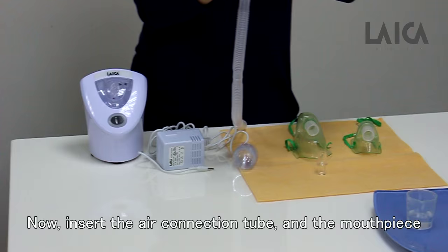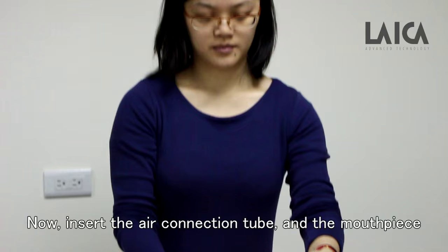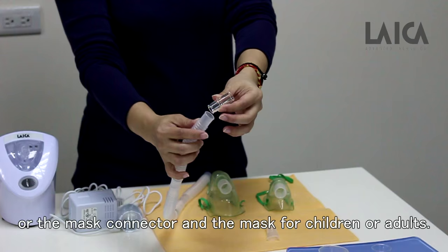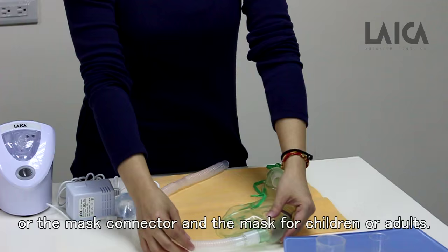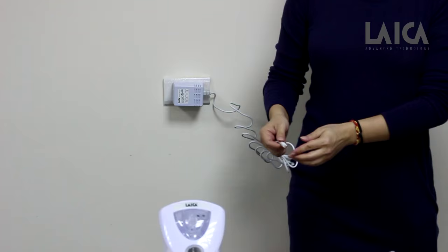Now, insert the air connection tube and the mouthpiece. Or the mask connector and the mask for children or adults. Connect the transformer with power source. And then the power supply plug to the nebulizer.